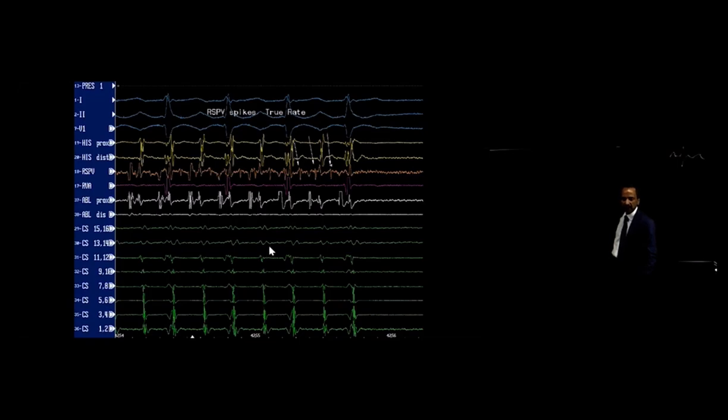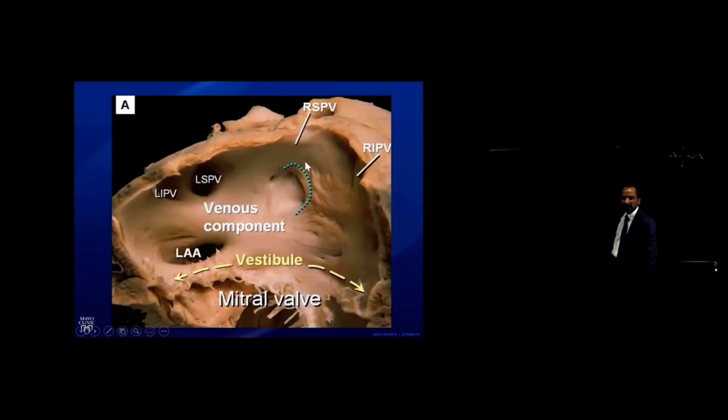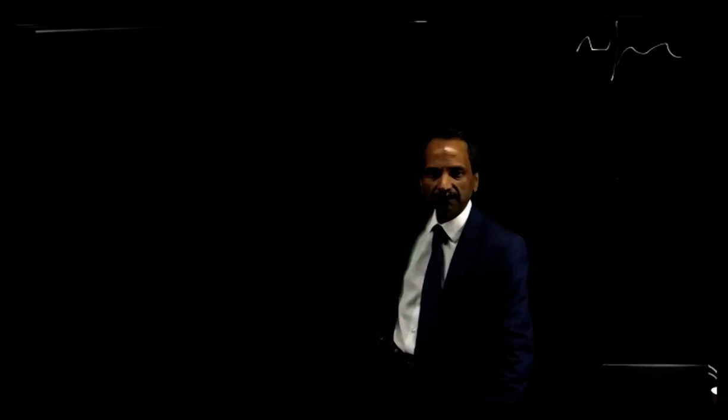What really needed ablation, and what was done in this patient, was isolation of the pulmonary vein, and that takes care of these flutters. Now we'll come back later after we look through some of the questions about how we transfer our understanding of cavo-tricuspid isthmus flutter difficulties and use that knowledge when we're dealing with other obstacles and other portions of the atrium, especially post-ablation flutters.